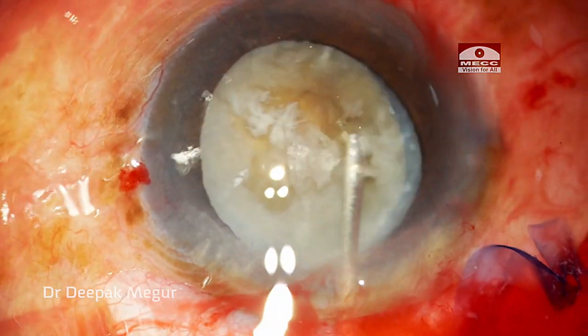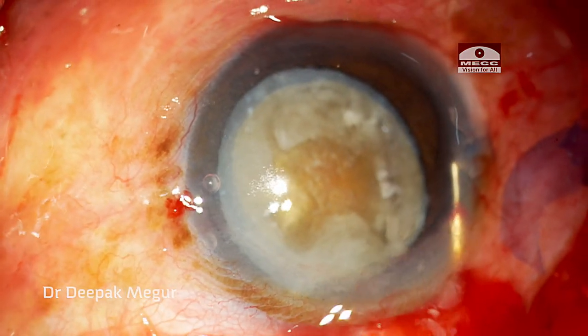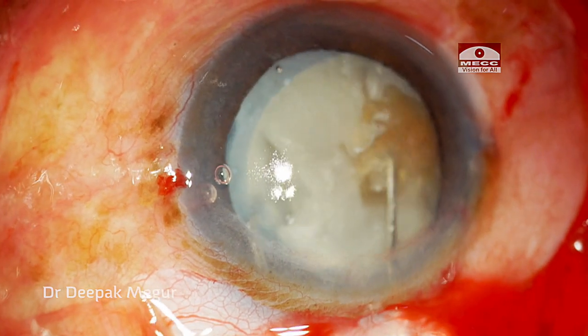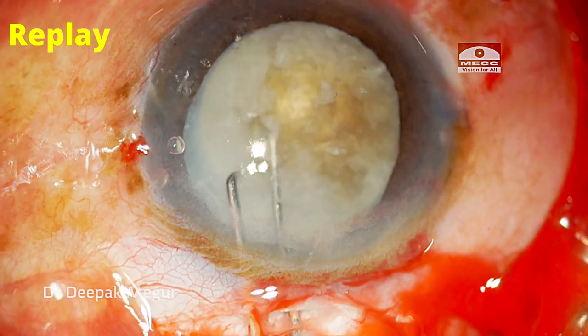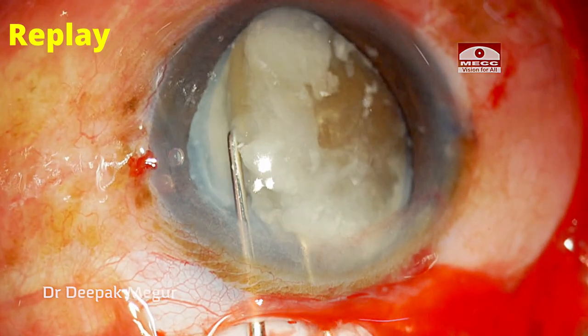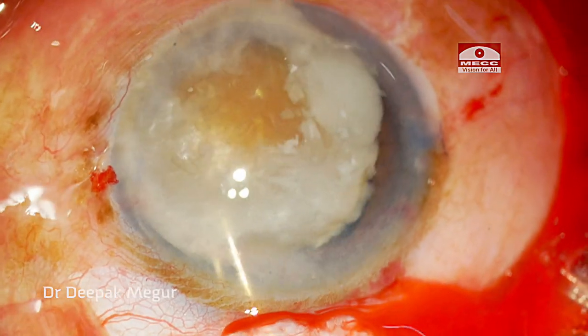Gentle hydrodissection aids in loosening of the cortex and also aids in the mobilization of the nucleus. This is the bimanual method of mobilizing the nucleus out of the bag using two Sinski hooks. One hook is pushing the nucleus down while the second hook is engaging the equator of the nucleus, and then using the two instruments the nucleus is rotated out of the bag.